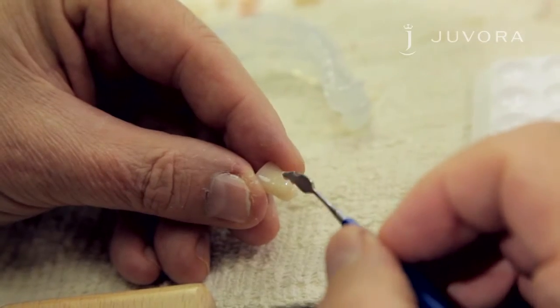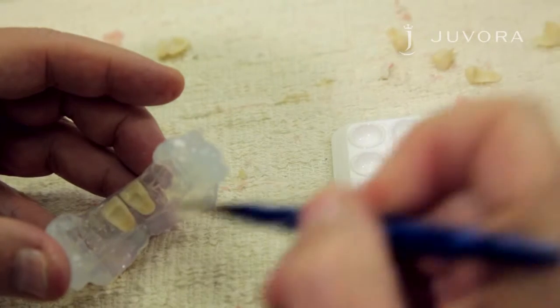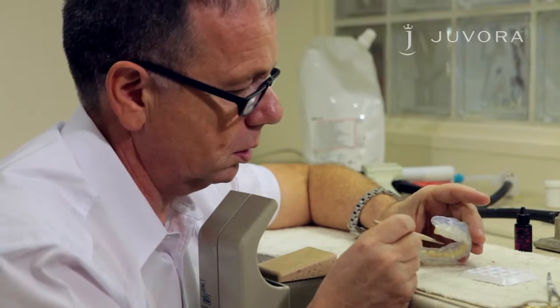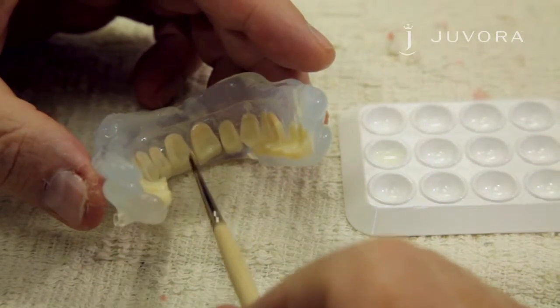Next, you need to glue the teeth to the transparent silicone. Superglue can be used to attach the teeth to the silicone. Bonding fluid is necessary for the bonding of the composite flow.